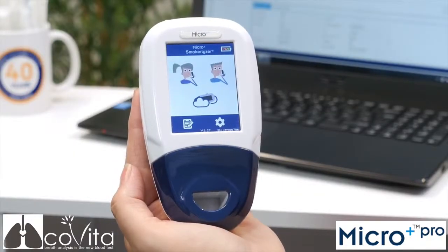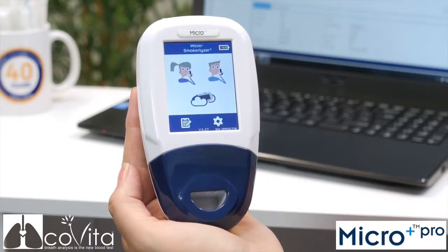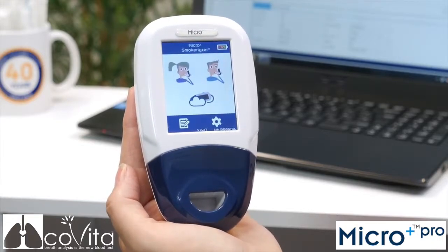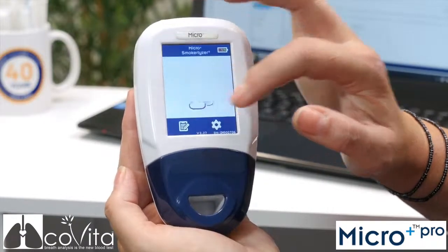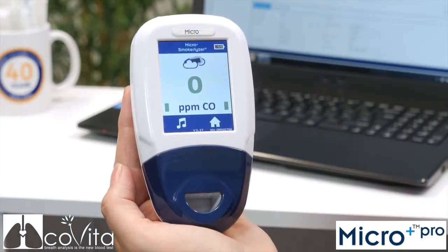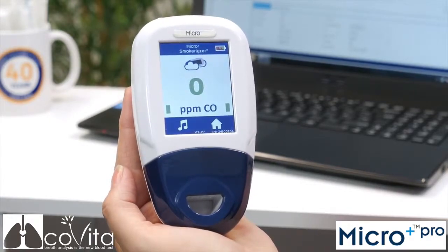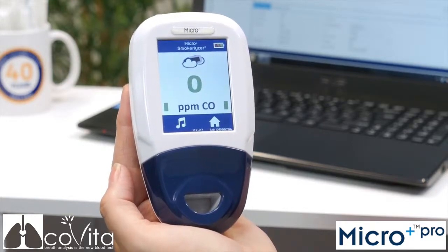The Micro Smokerlyzer has the ability to measure ambient levels of CO, which might detect why a non-smoker is giving off a high reading. To begin immediately monitoring environmental CO levels, click the ambient monitoring icon. The Micro Smokerlyzer will immediately begin sampling the atmosphere, and if there is any atmospheric CO, the readings will rise on screen.